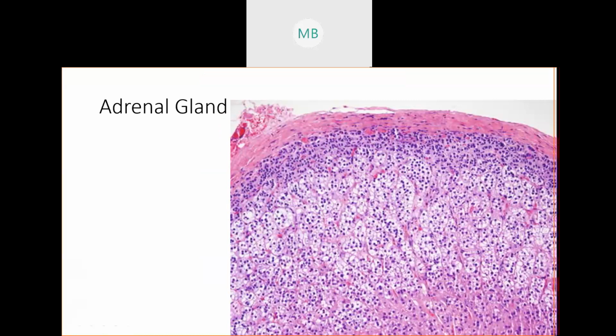And that brings us to your adrenal gland. Your adrenal gland is a colossal pain in the rear end. Like, I'm sorry, I cannot sugarcoat that. You guys have to know the layers of your adrenal gland because your adrenal gland comes in layers and it is painful. So here we can see the outer capsule plus the cortex layers.